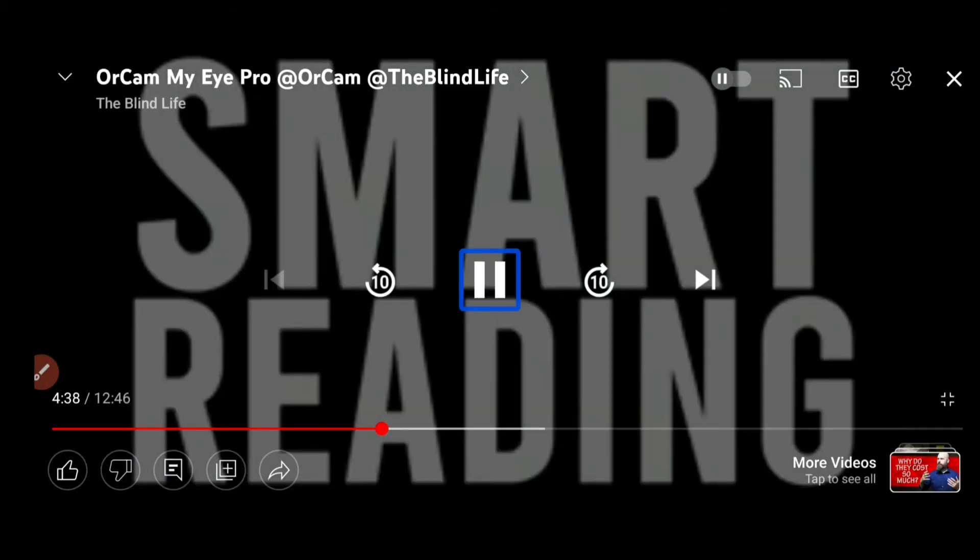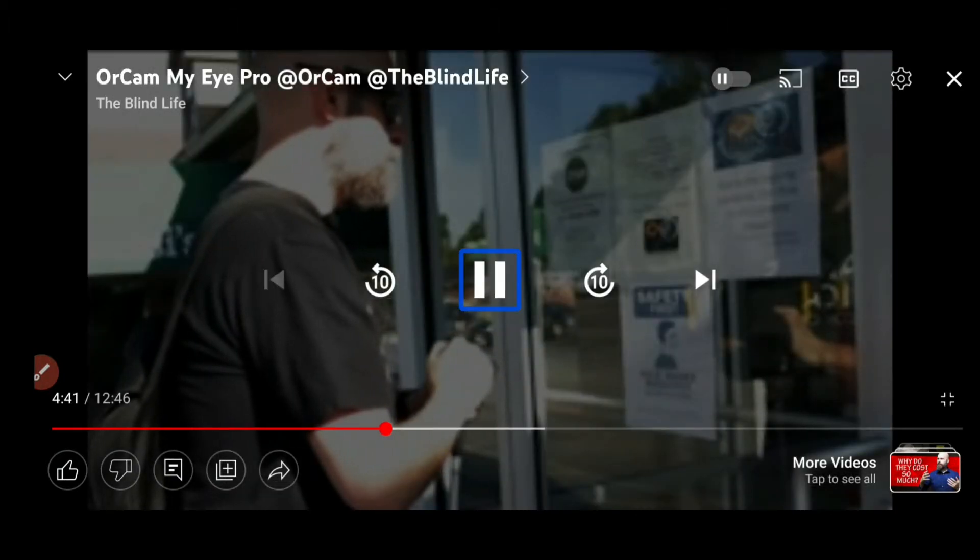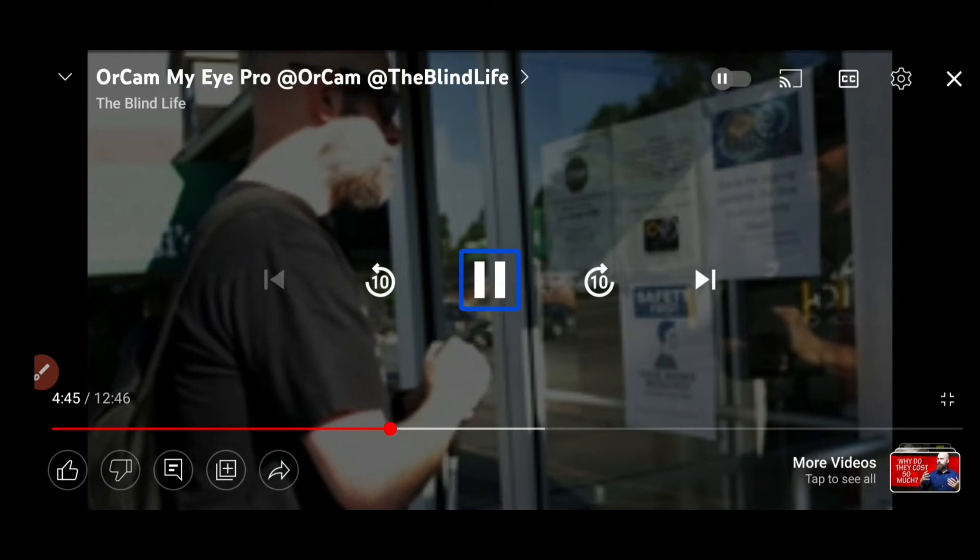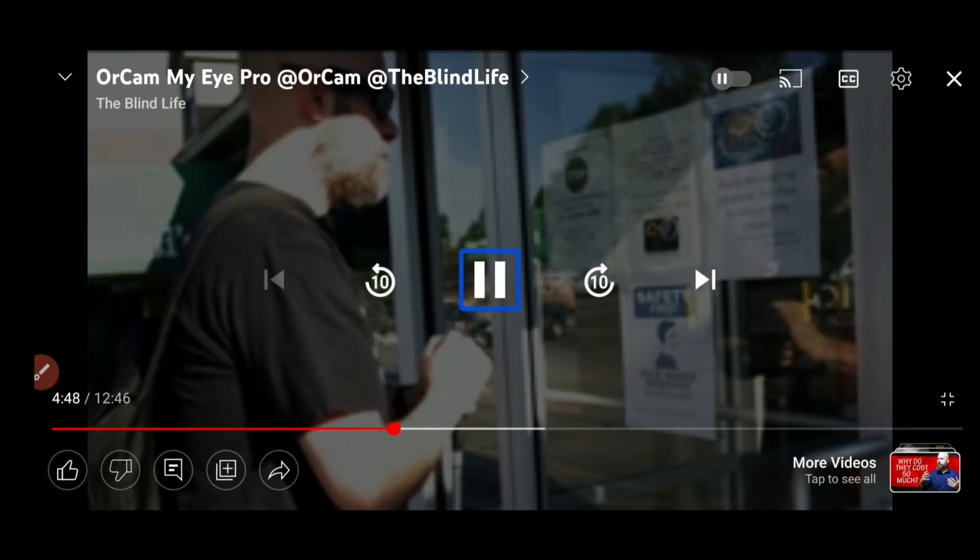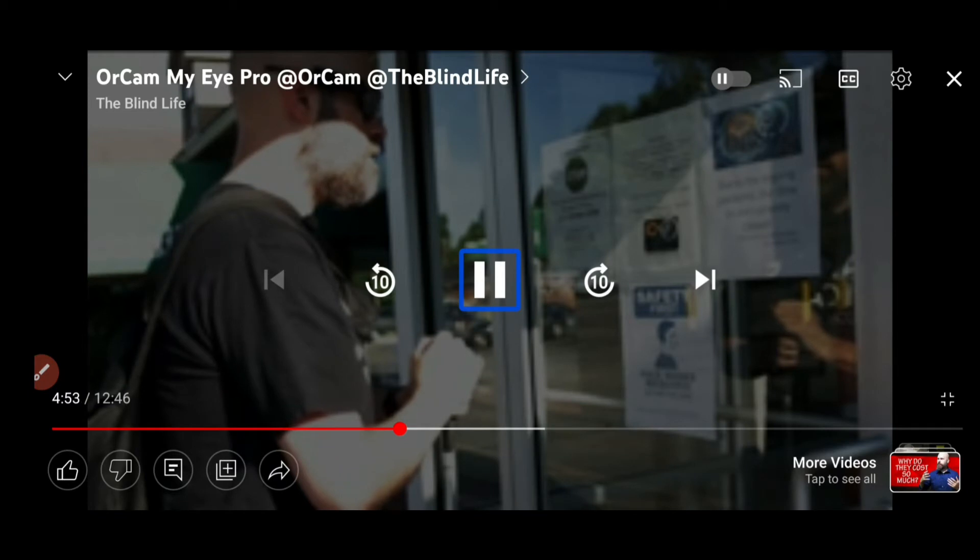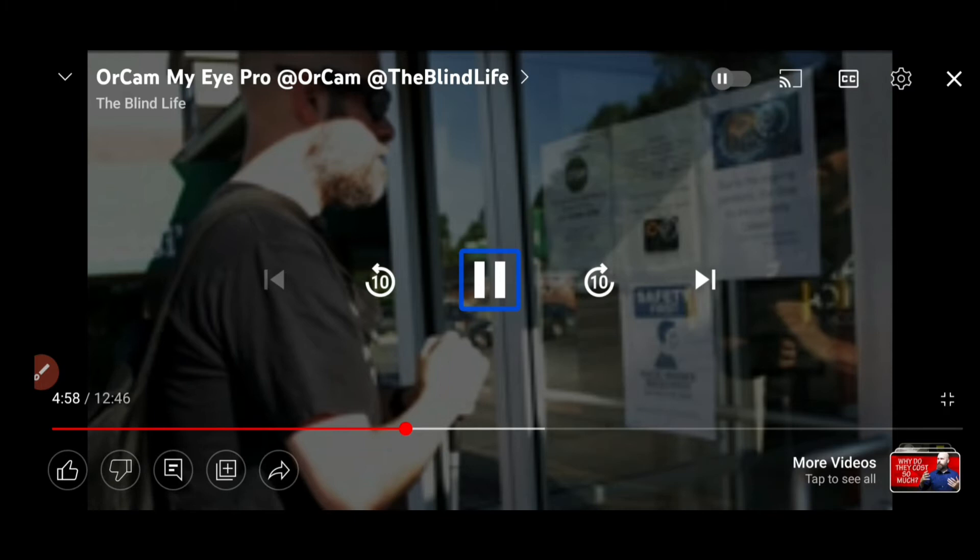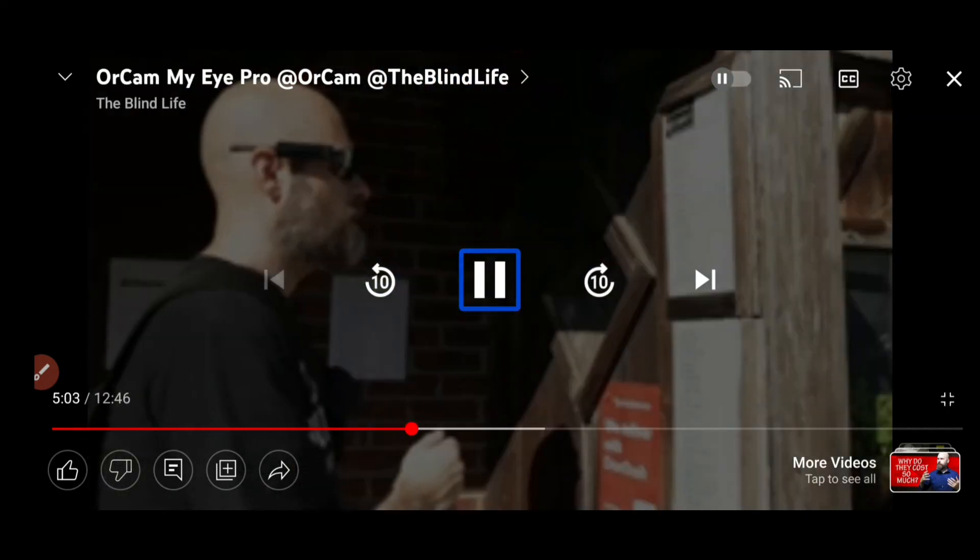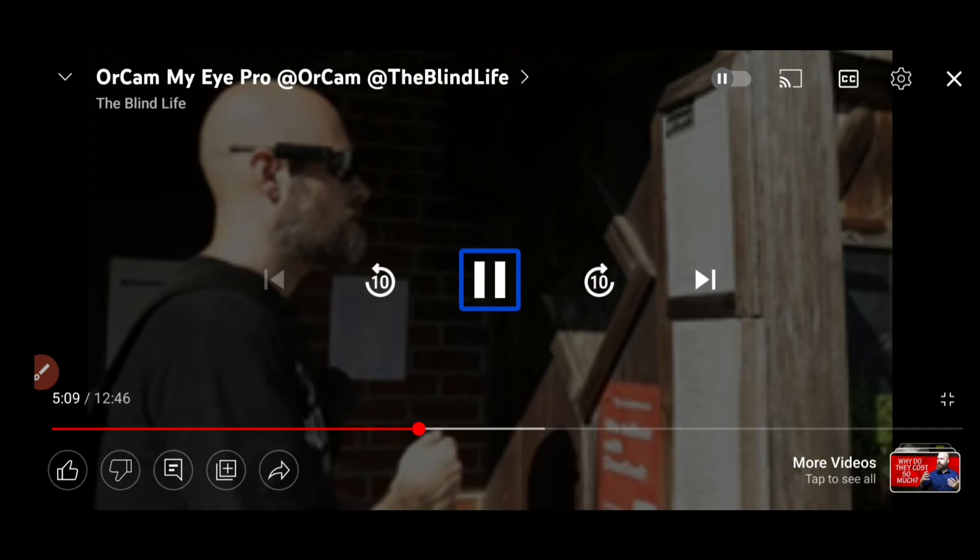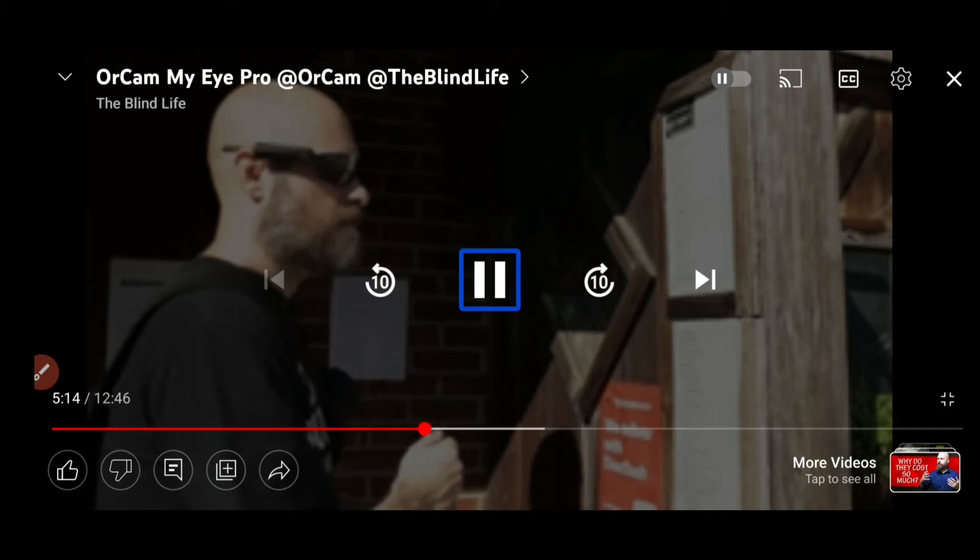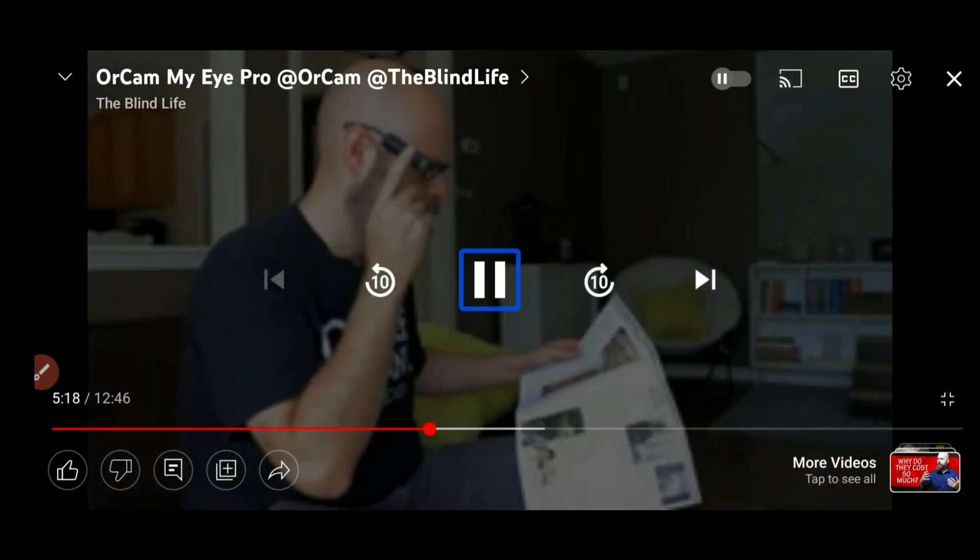Pause video. Smart reading. Note that some of the text was unreadable. Ready. Read phone numbers. Found one phone number. To place a carryout order, call 269-6440. Read amounts. Found 11 amounts. First result, $7.99. Second result, $7.99. Third result.